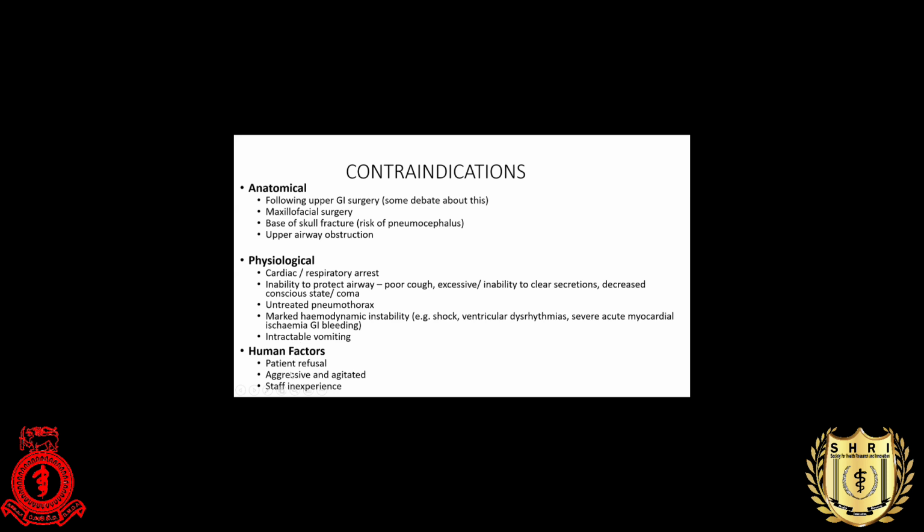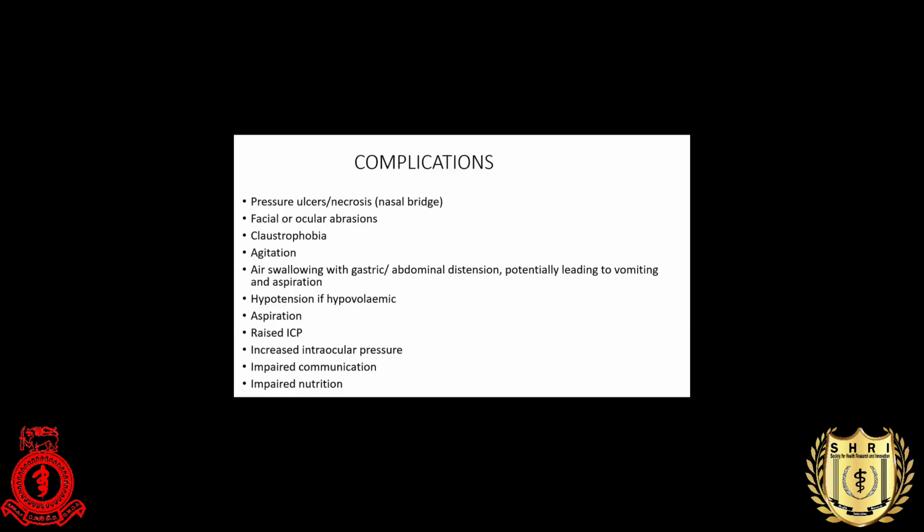When it comes to the human factor, if the patient refuses, especially in palliative care, you are not going to put it on. And if there is an aggressive or agitated patient, it is very difficult to use this. And staff inexperience.